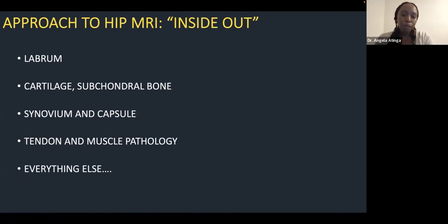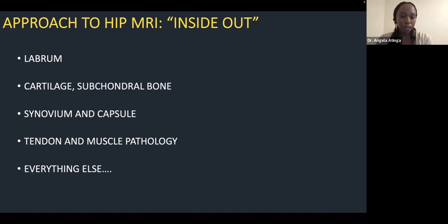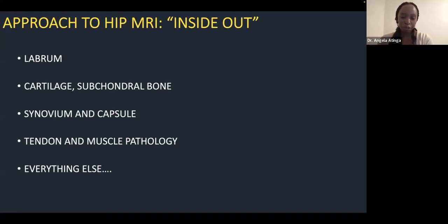My approach to hip MRIs uses an inside-out method. I start with the labrum, then look at the cartilage and subchondral bone, then the synovium and capsule of the hip, then the tendons and muscles around the hip. Finally I go back to review the large field-of-view images — making sure I've looked at the whole pelvis, bones, muscles, SI joints, and anything else in the field of view. Always remember to look at your scout images as well.